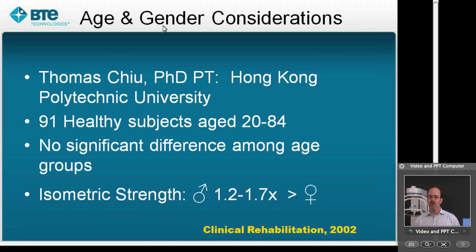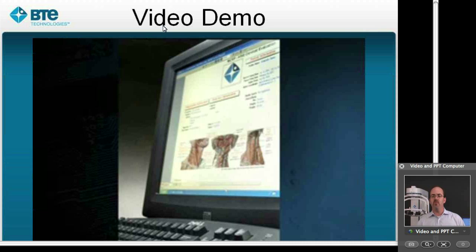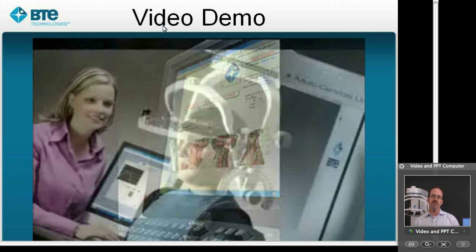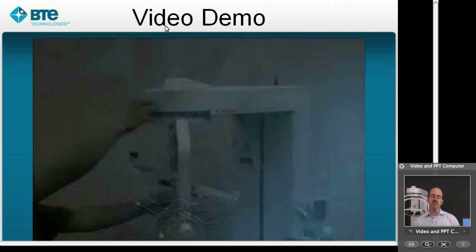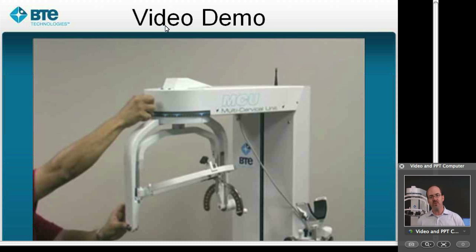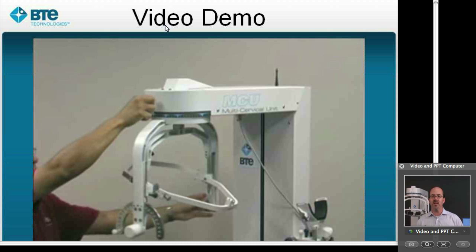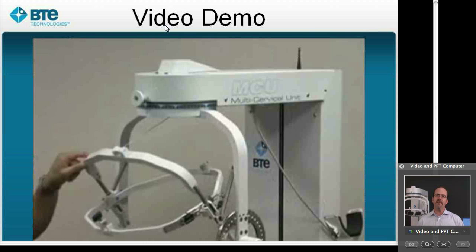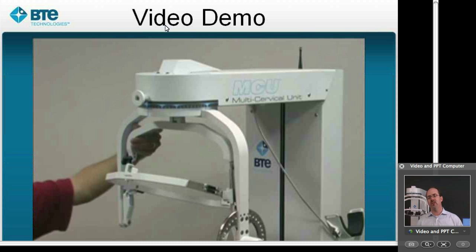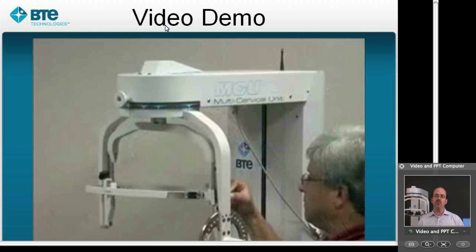What we're going to do now is take a brief look through a video demo to give you some background as to how the system collects the data and how we use it. It's important to note that the system moves in all three planes of motion, so we're going to collect data in the sagittal, frontal, and transverse plane — whether it be forward flexion and extension, lateral flexion, or rotation. We're going to capture range of motion in all three different planes.